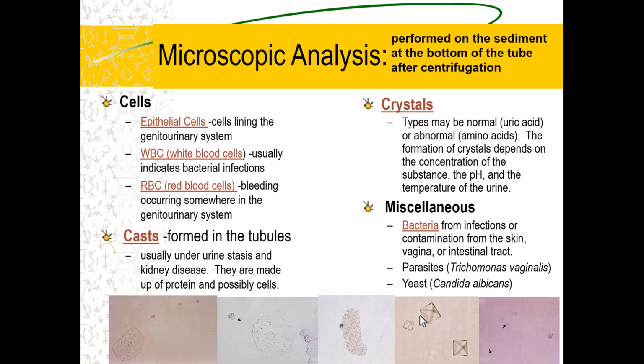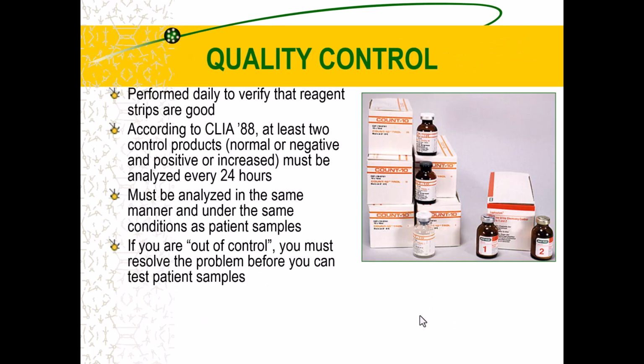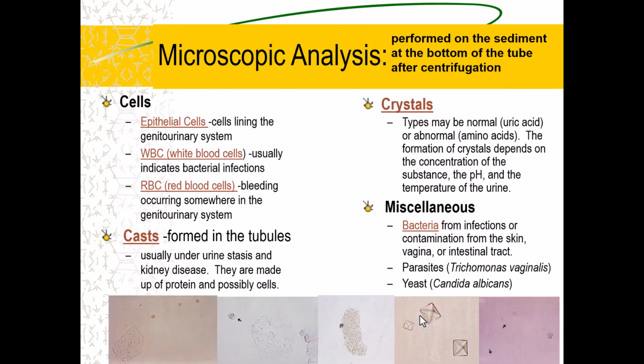It's not just for patient tubes either. If you're in a pharmaceutical setting and you're trying to figure out dosages, and you're working through a batch, it's in those settings too. They make you run the QC before you do the samples. I always wonder, when you get out of the lab setting, QC is this magic concept that may or may not happen. It's always kind of interesting.